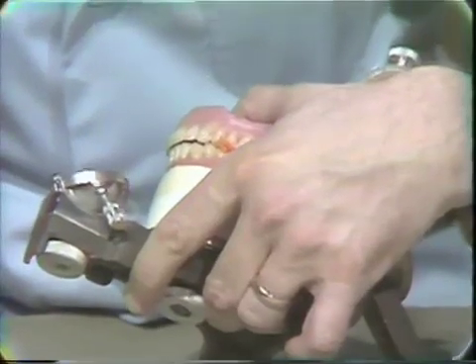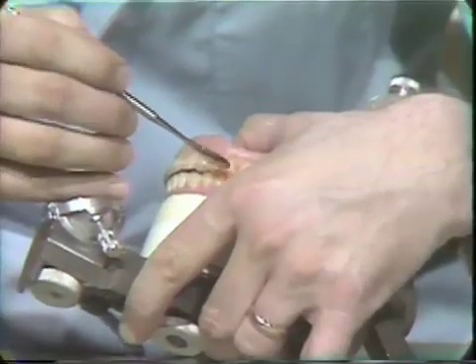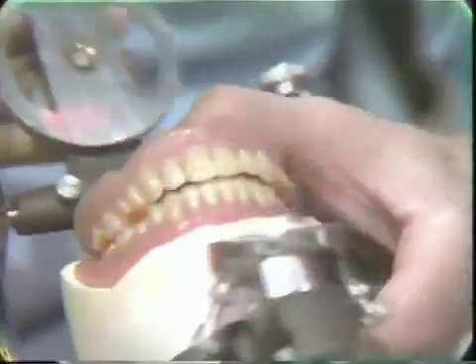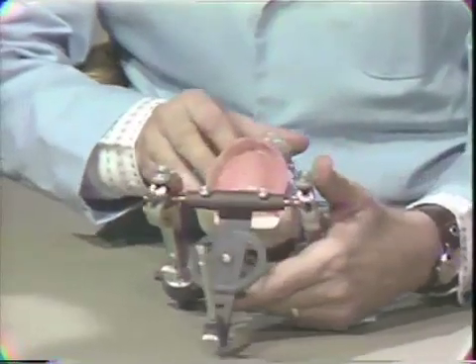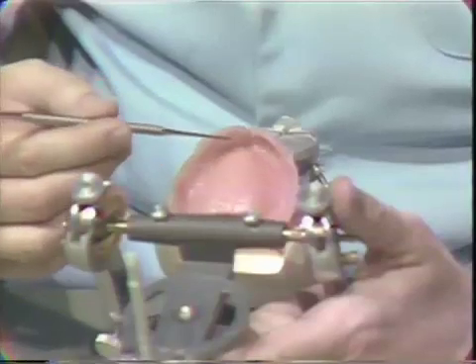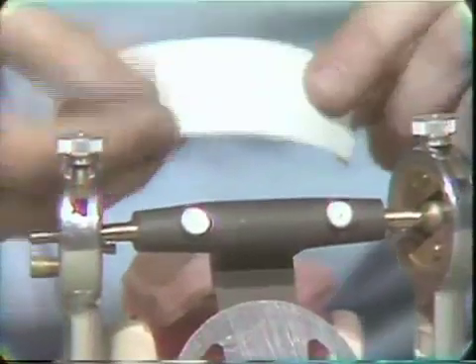What I'm going to demonstrate is not by using wax but just by using a little wet asbestos to block out that undercut before we pour the plaster. Now at this point that has been luted together — make one last check to make sure that the occlusion looks proper to you. If it's not, do this step over again because this will affect the ultimate configuration of the occlusion. We're going to do our selective grinding from this procedure. Now I'm going to turn the denture this way so you can see the area I'm talking about. We have a very small undercut in this case in the labial vestibule area.